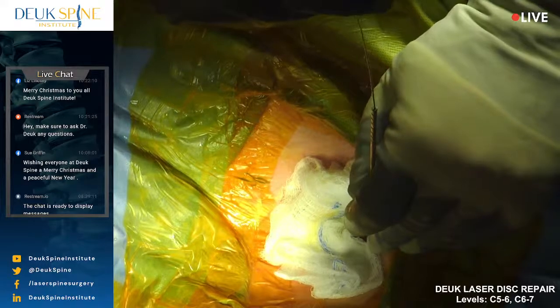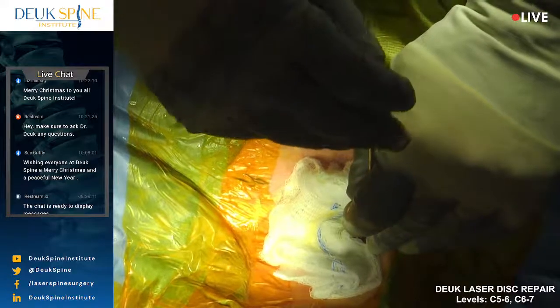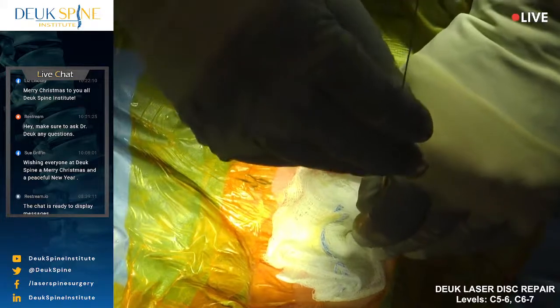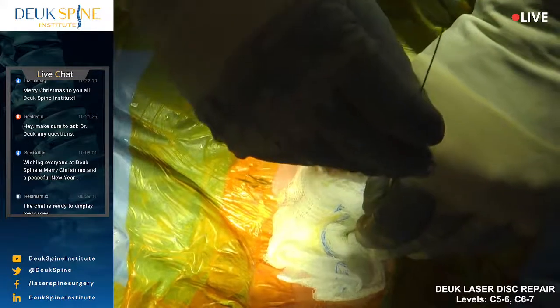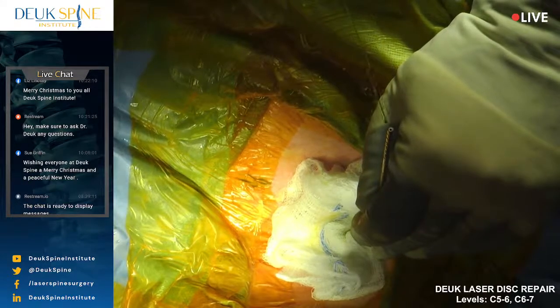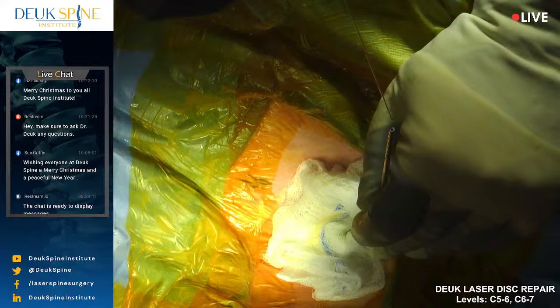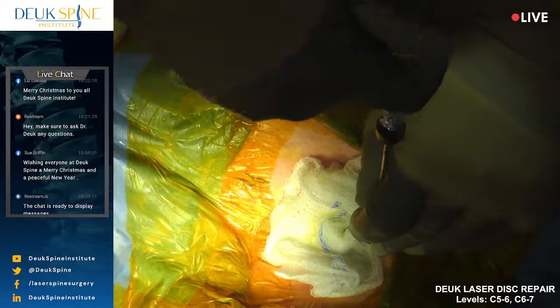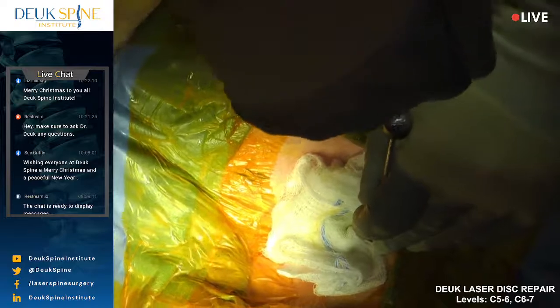This disc, I think, is a bit more scarred up. At least that's what I'm feeling. The more scarred a disc is, the less likely you can do the discogram. It's all scar tissue. It's very scarred up from inflammation. This is part of the degenerative condition of the disc. Discs degenerate because of inflammation, and inflammation causes scar tissue.